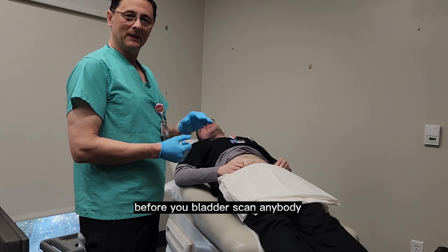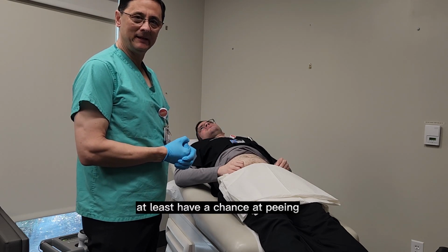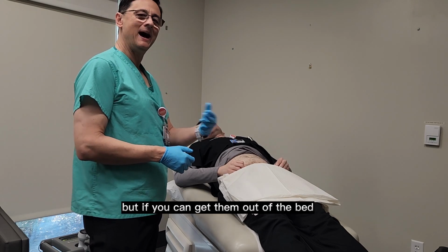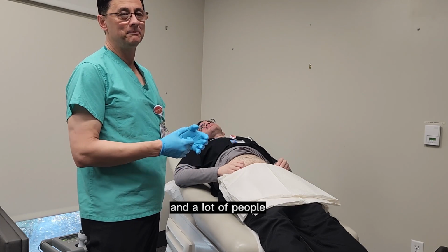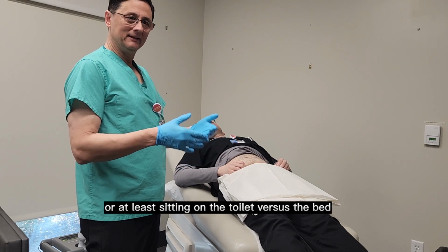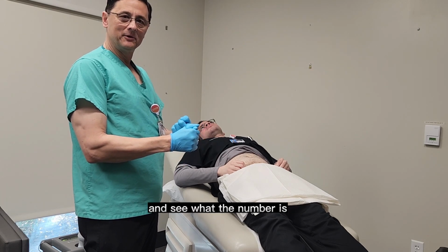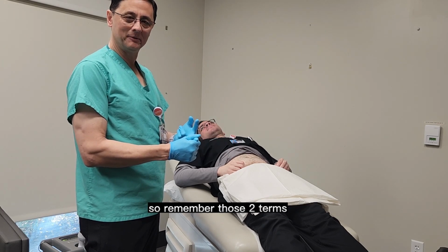So before you bladder scan anybody, typically I want them to at least have a chance at peeing. And it's best if you can get them up and out of the bed, not on the bedpan, not peeing in the bed, because gravity can help us stimulate that urge to pee. And a lot of people, men and women, can pee easier when they're actually standing up or at least sitting on the toilet versus the bed. So again, random bladder scan, you just scan them at any time and see what the number is, but more often than not, we want what's called a post-void residual, after they pee. So remember those two terms.